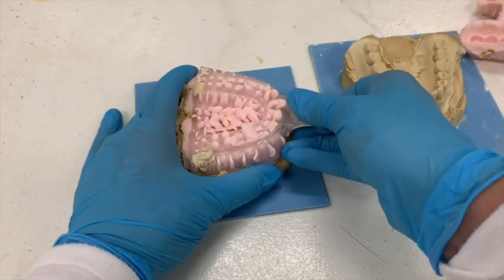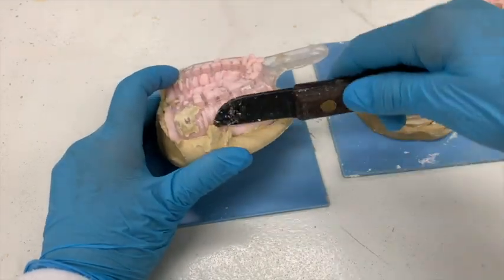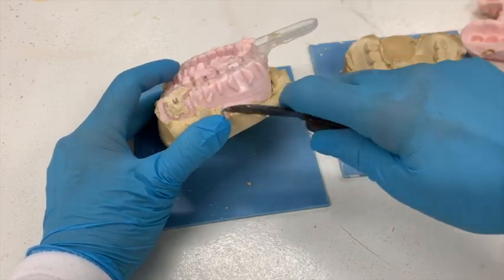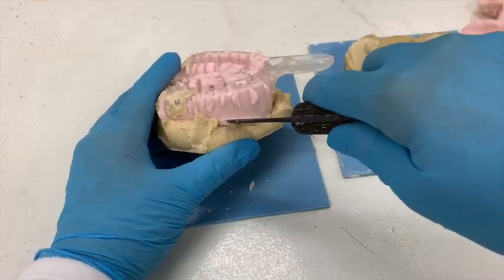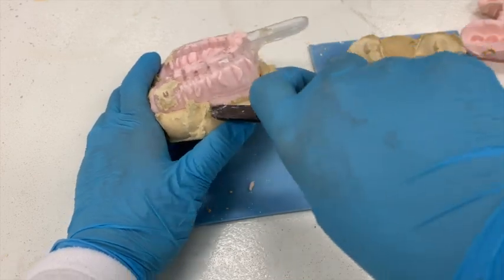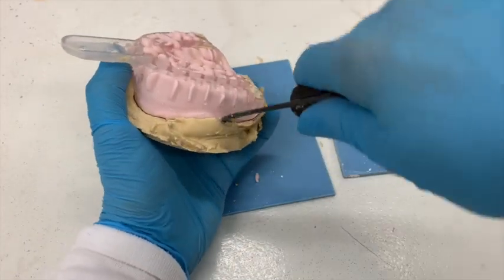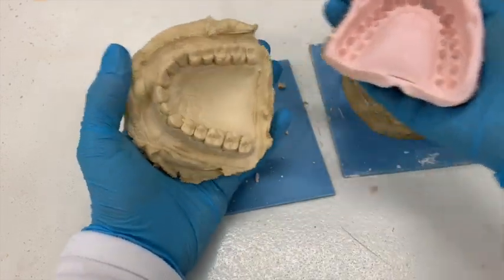Let's try this one over here. This one's not coming off quite as easy. So what you can do is, if you have any spots where gypsum came up over the impression, you can use your lab knife to chip it away — carefully break some of those pieces away. Then take your lab knife and stick it at the base of where your impression meets the gypsum, and give it a little pressure to move it up. You can do that on both sides, give it a twist, and then wiggle your impression away.